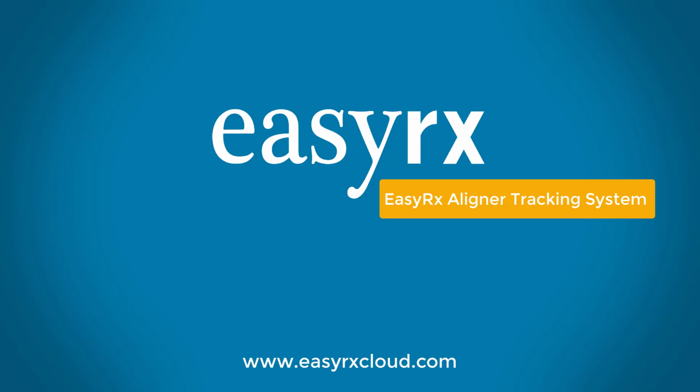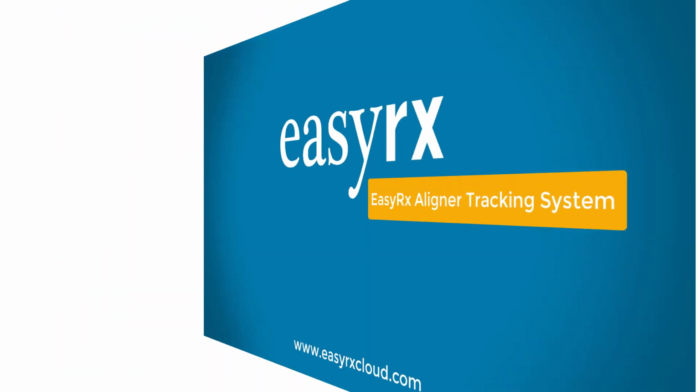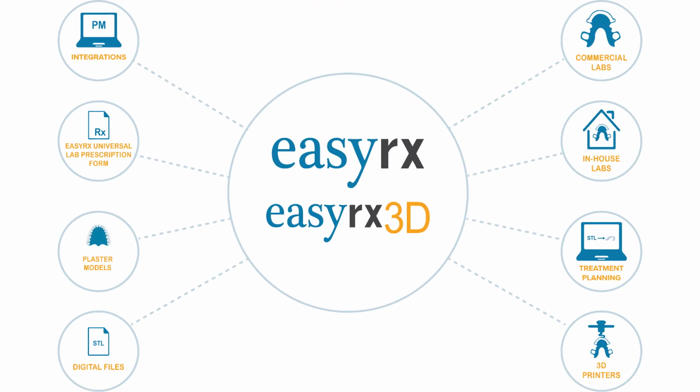We're excited to show you a closer look at EasyRx. EasyRx is a universal lab prescription, digital workflow, and 3D software for practices and labs. Let us show you how EasyRx helps practices and labs better manage the entire lab prescription process.